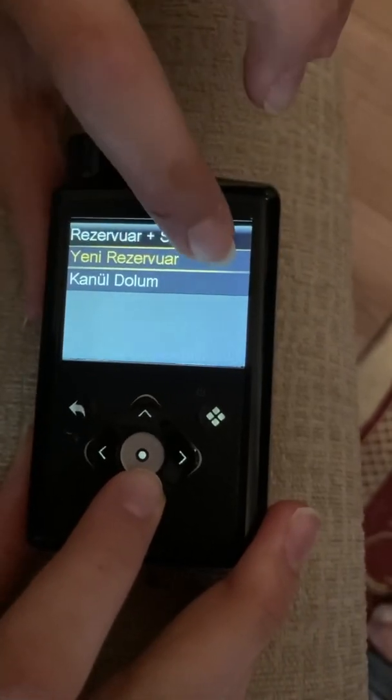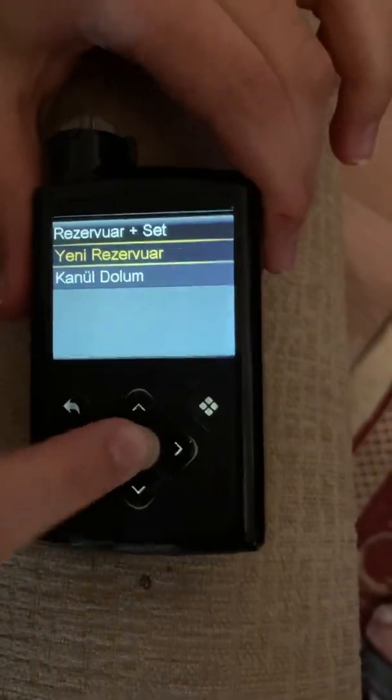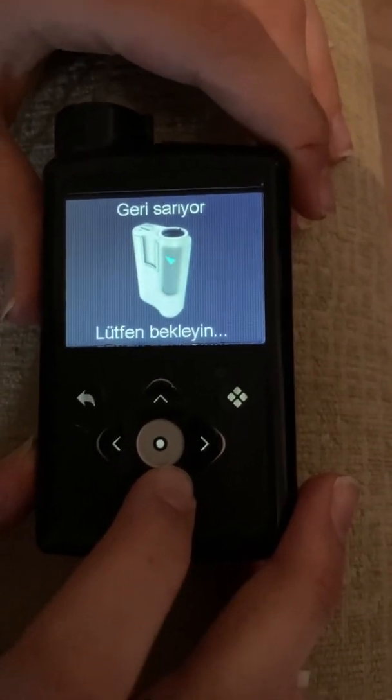Press this button again. If it asks whether you want to start a new reservoir, press the button again. Now you have to wait until it shows another screen. In the meantime, I'm removing the old infusion set from my body.